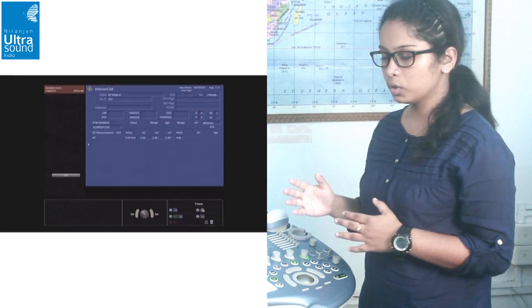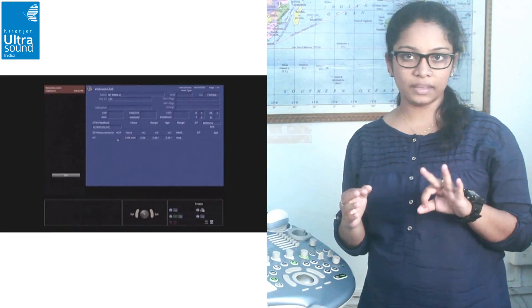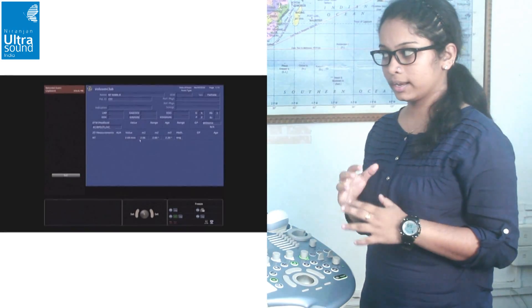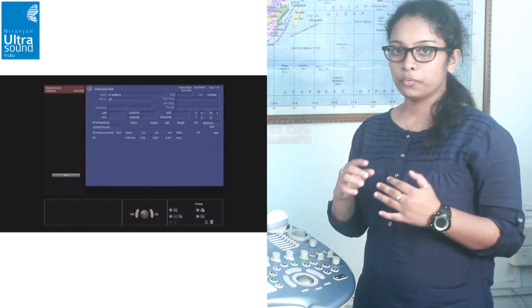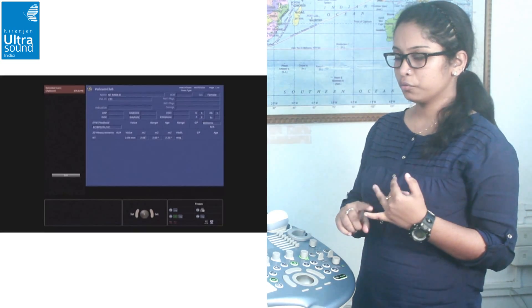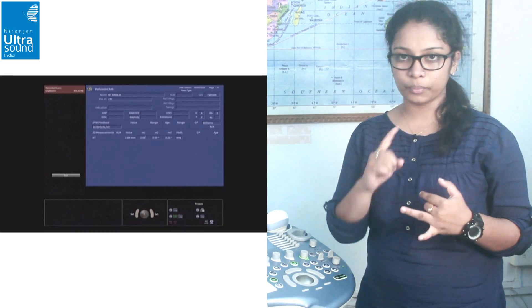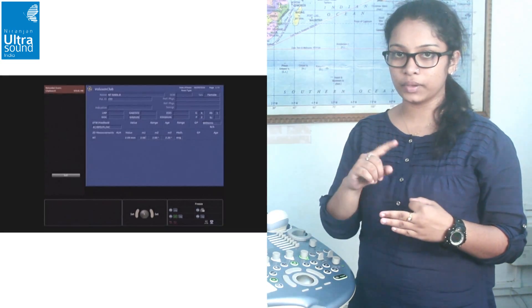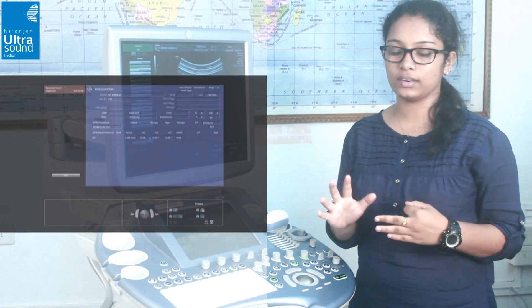Now we go to the report. Here we have three measurements: without a footnote is the manual measurement, footnote 1 is from inner to inner, and footnote 2 is inner to middle.